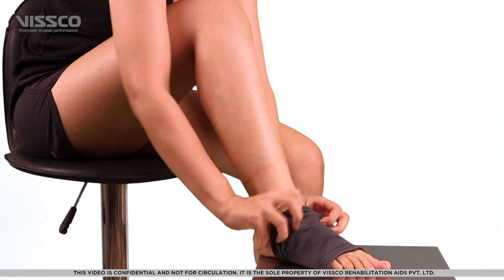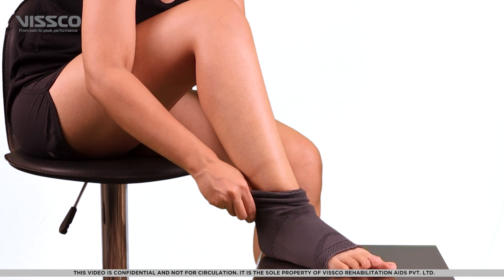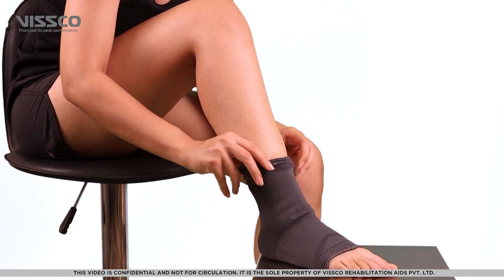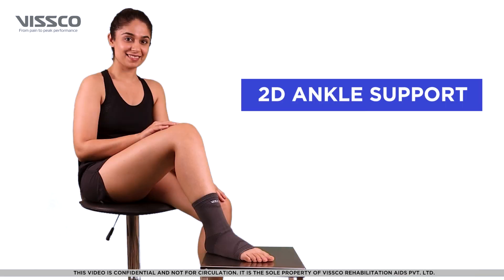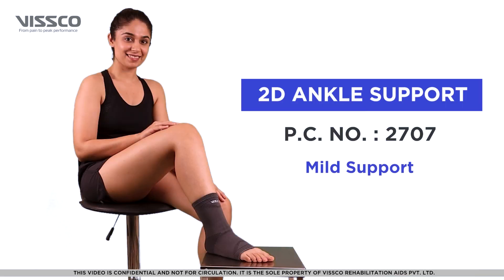Make sure that the rib portion on the support comes over your heel. Congratulations! You are now wearing the product correctly.